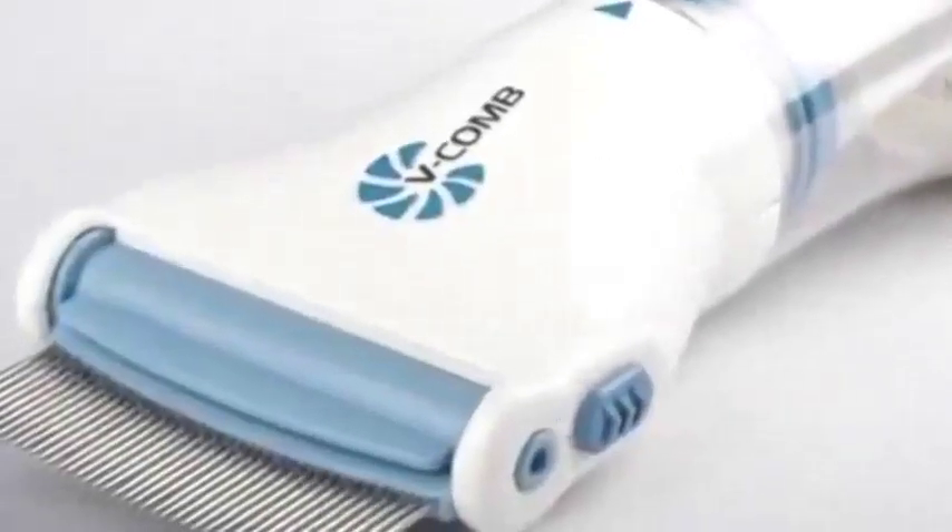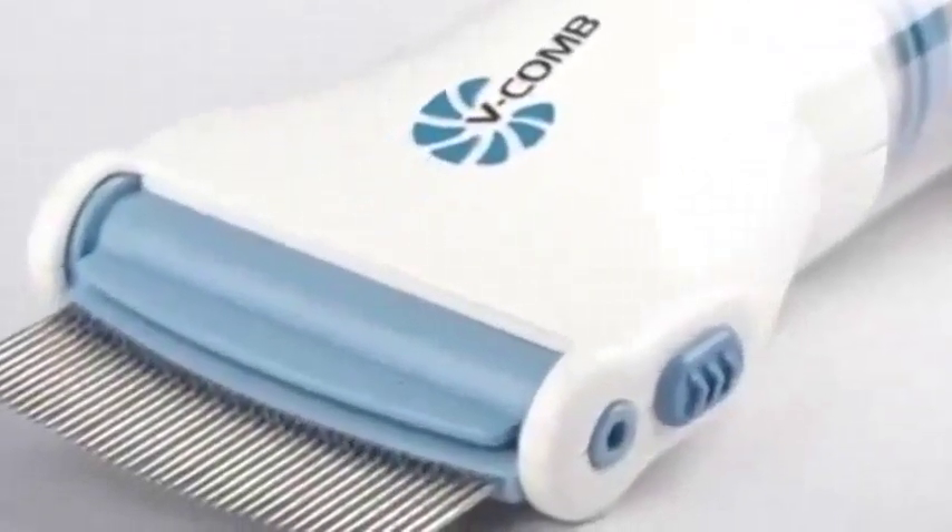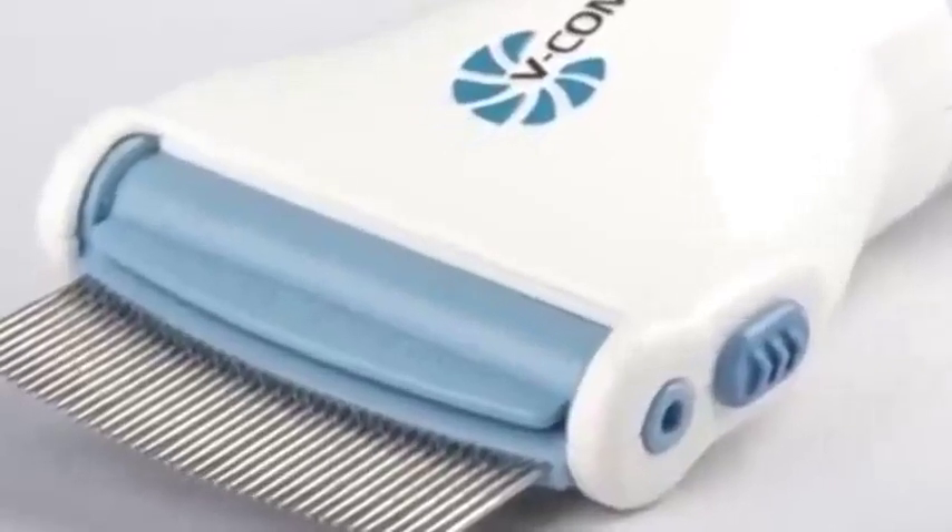This family-owned company has developed a revolutionary device that incorporates combing and vacuuming to eliminate head lice and eggs. The V-Comb.